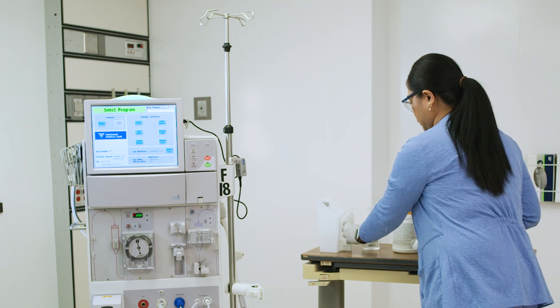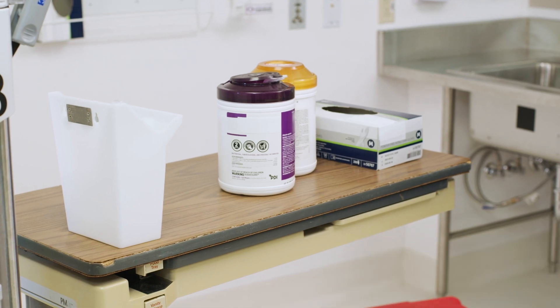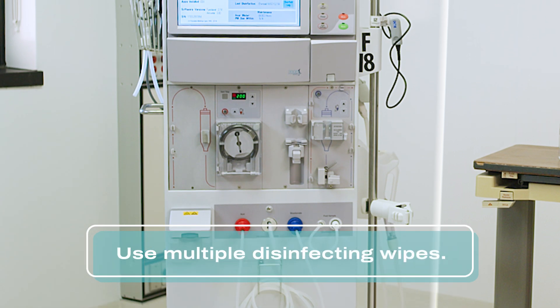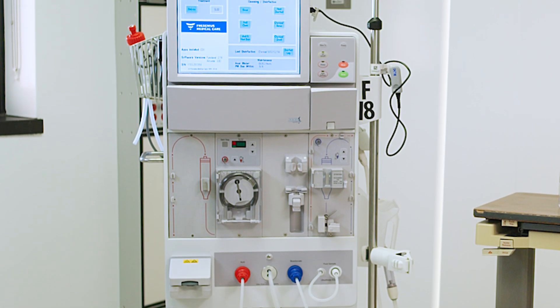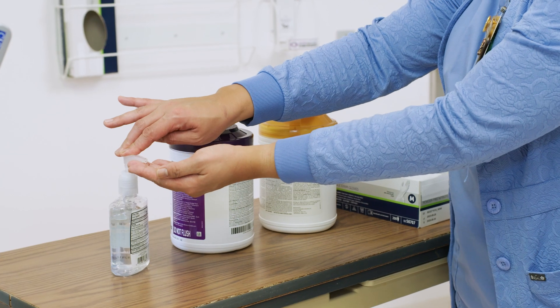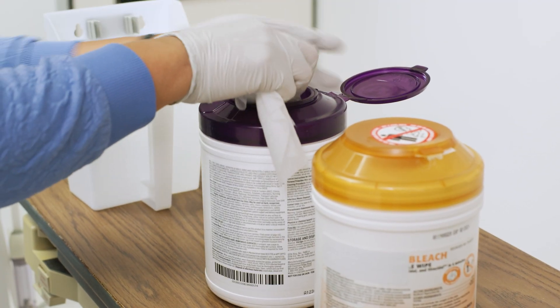Always keep disinfected items and surfaces away from used or potentially contaminated items. We'll disinfect the machine one side at a time. Disinfecting the entire machine will take multiple disinfecting wipes. Remember, as you go, all surfaces should be visibly wet with disinfectant for the recommended time. Doff gloves, perform hand hygiene, don new gloves, and grab another wipe.